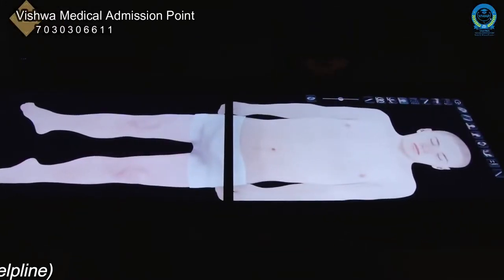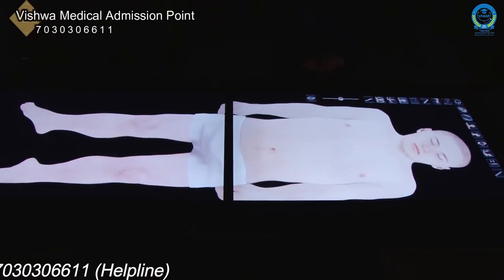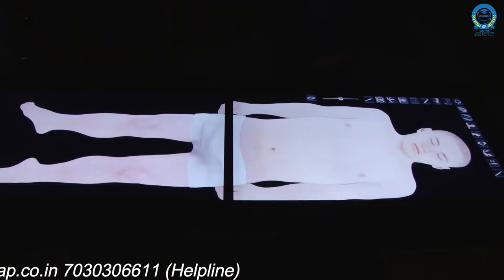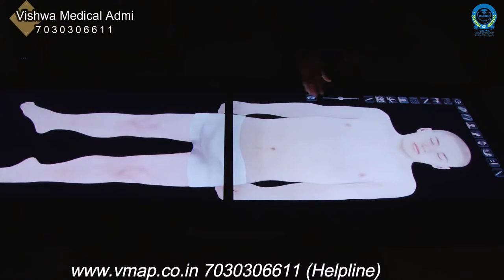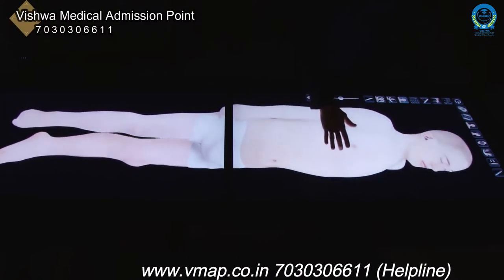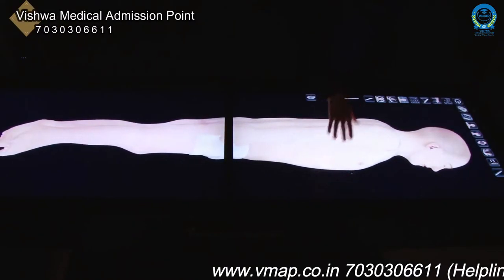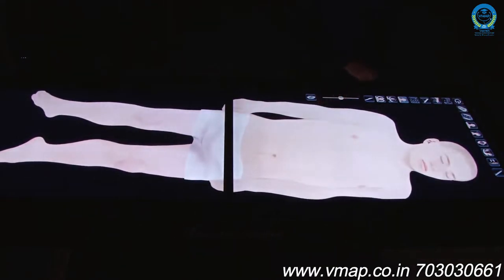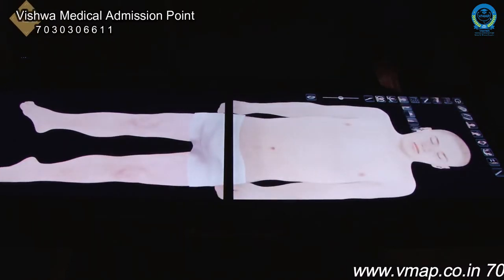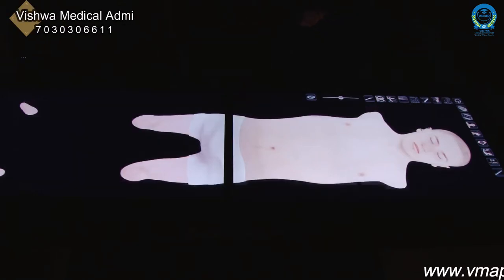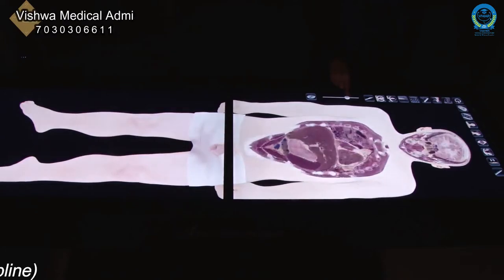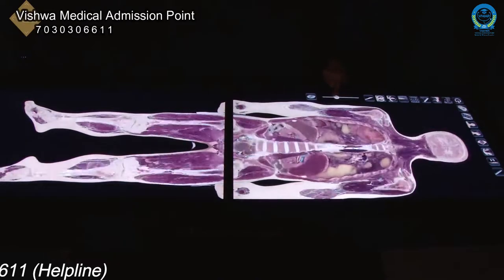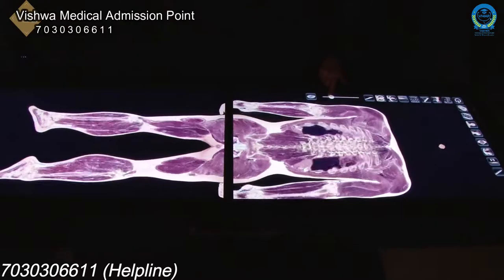The Anatomage Table is essentially a 7-foot iPad that contains fully rendered — meaning fully scanned — male and female cadavers, body models through CAD drawings, case studies of human pathologies, fully rendered animal bodies, and high-resolution regional body scans. It is a state-of-the-art piece of equipment that very few colleges and universities have available for student use.